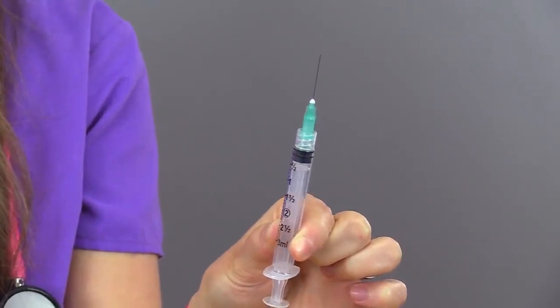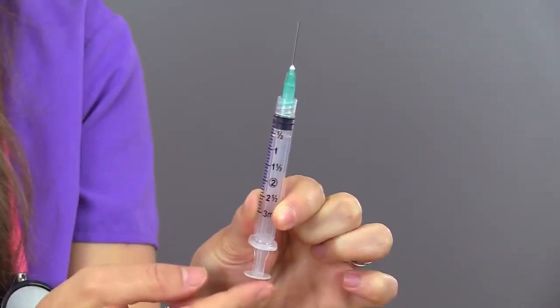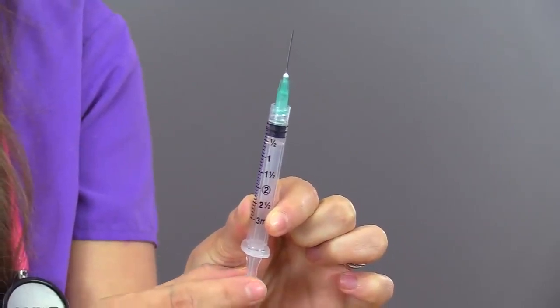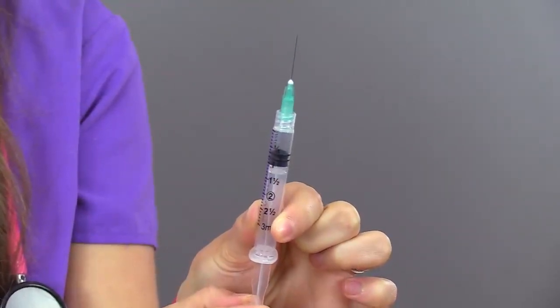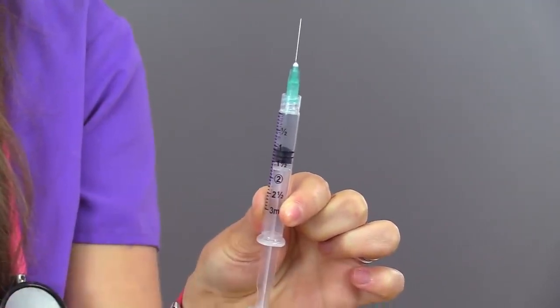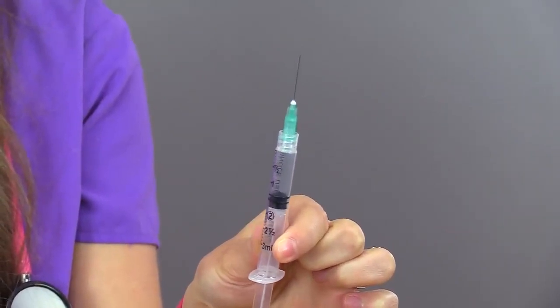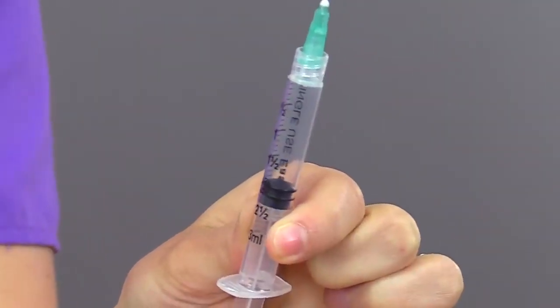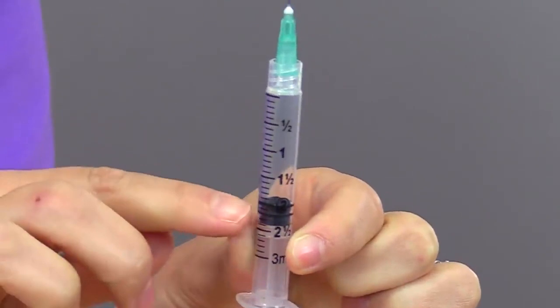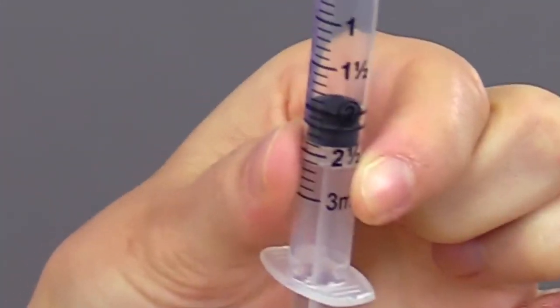And we're ready to instill the air. So we're going to carefully pull on this flange of the plunger. We're going to pull it back, so you'll be pulling it down, and you're looking at the markings on the syringe. So we're giving 2 mLs of medication. So we're going to pull back at the 2 mark, and you want to make sure that the plunger seal lines up with that 2. And here we have 2 mLs of air.